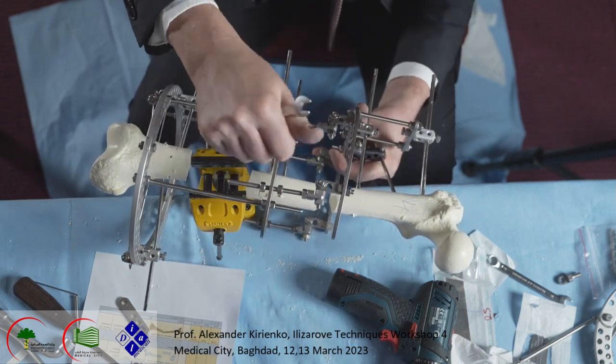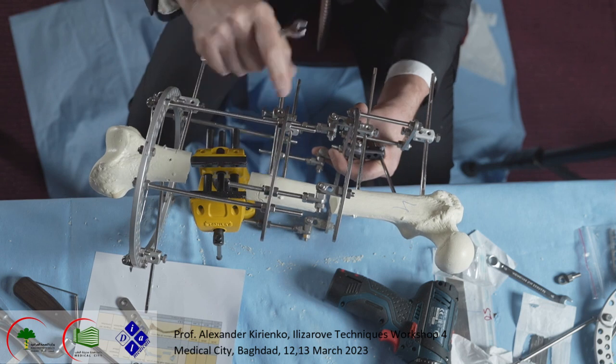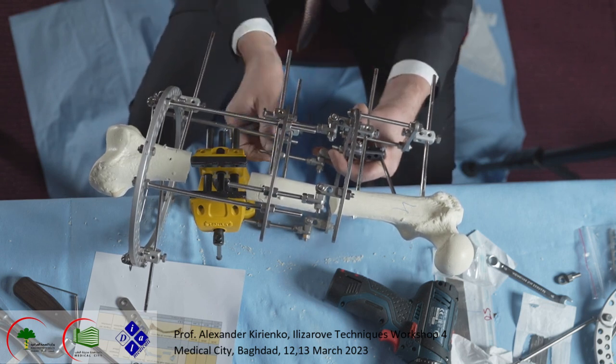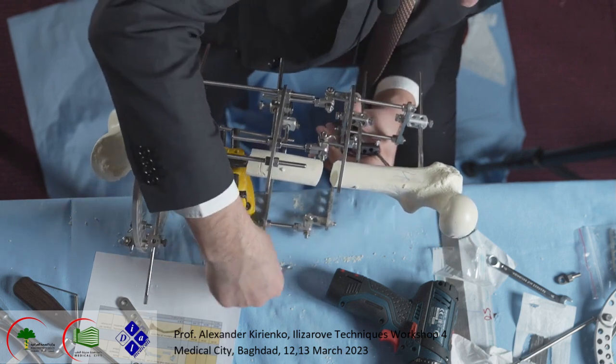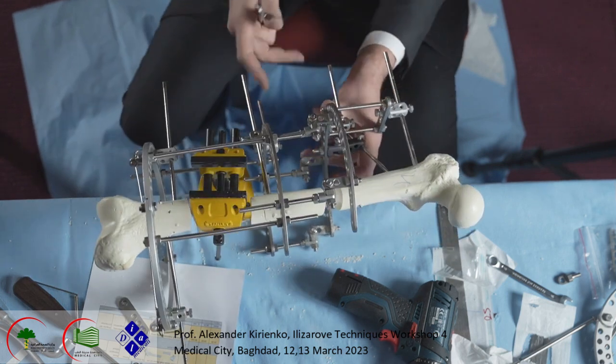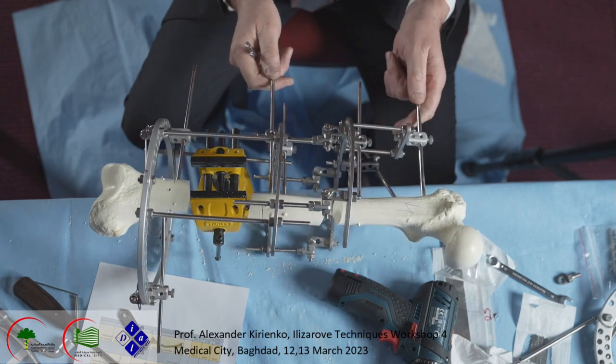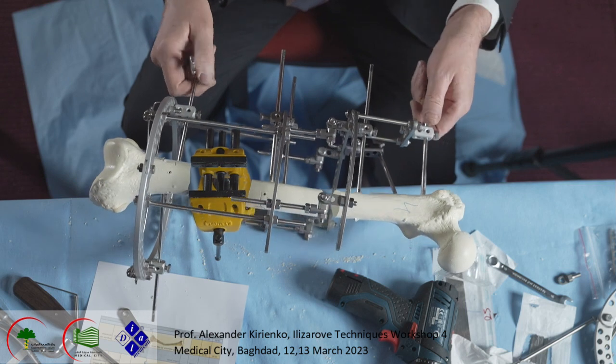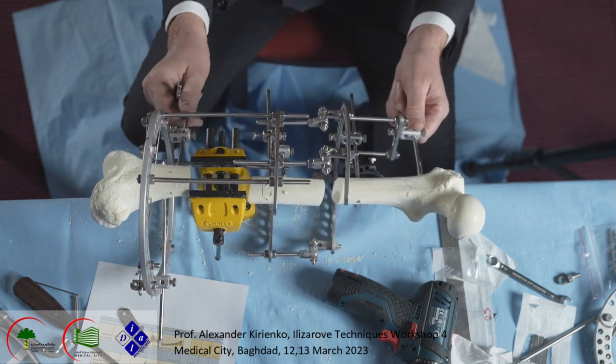Okay. And this system now, like you see, it looks nice because we don't have muscle tension. You see, the lengthening procedure is easy, really straight bone, no displacement, no any movement.